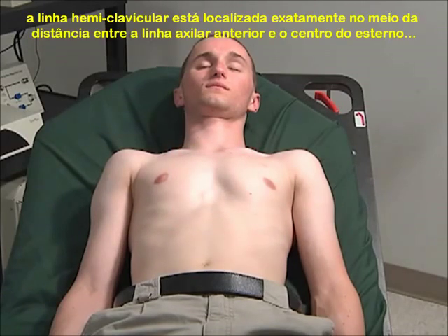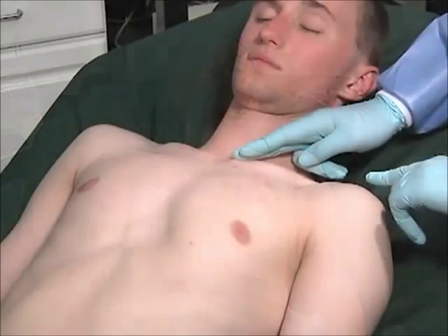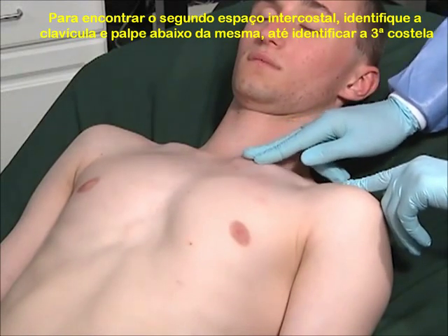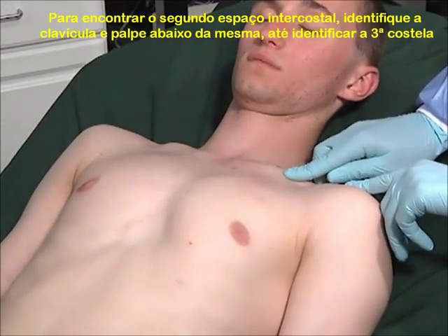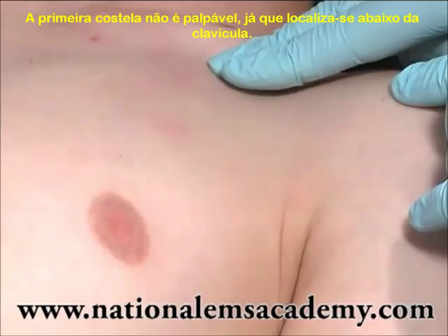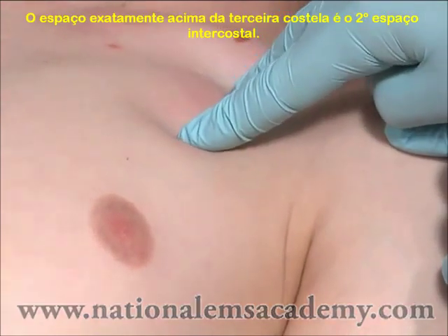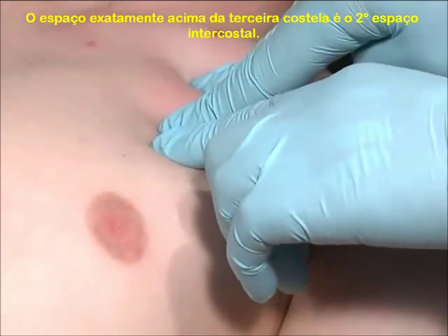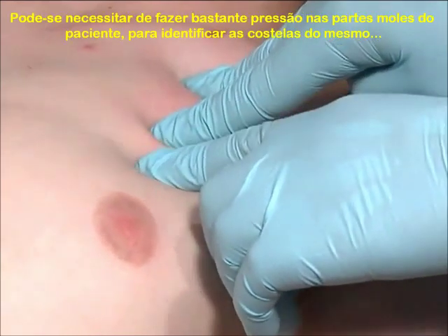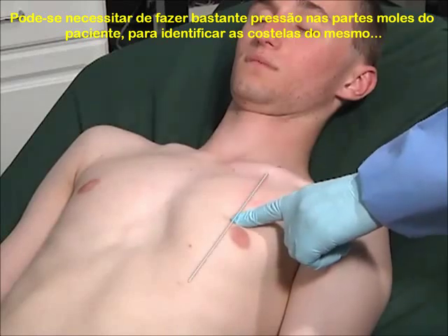This poses significant risk if the needle is inserted into the mediastinum. The mid-clavicular line is located midway between the mid-sternal line and the axillary line. To find the second intercostal space, palpate downward until you feel the third rib. The first rib is not palpable since it is behind the clavicle. The space directly above the third rib is the second intercostal space. You may need to apply substantial pressure to feel the ribs on patients with significant soft tissue over the area.